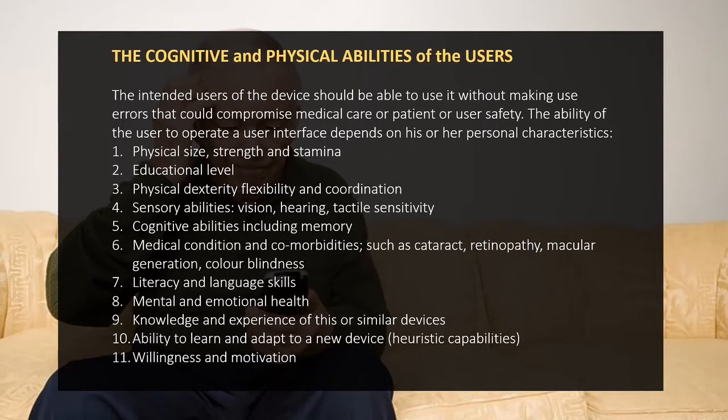Literacy and language skills. So I mentioned before that we're doing a user interface for a developing country in Vietnam, which has got 14 different languages. We've got to be careful that those icons that we develop mean something to all those different groups. The mental and emotional health of the person.